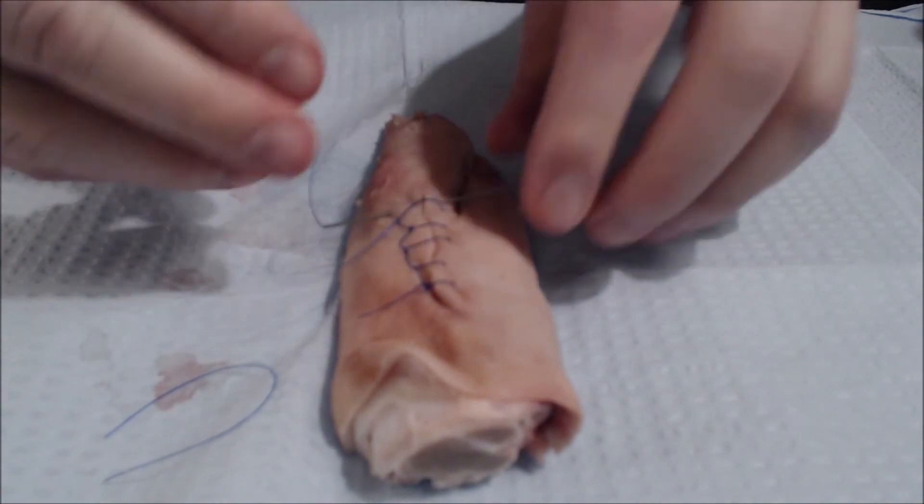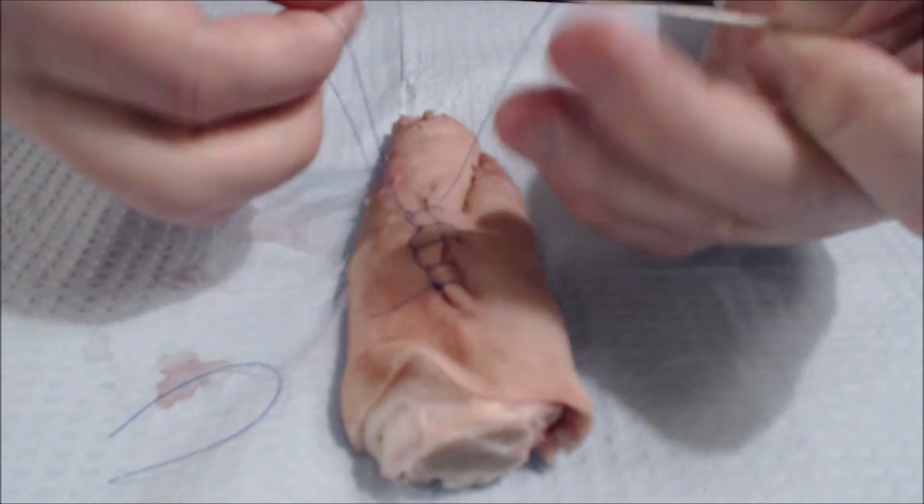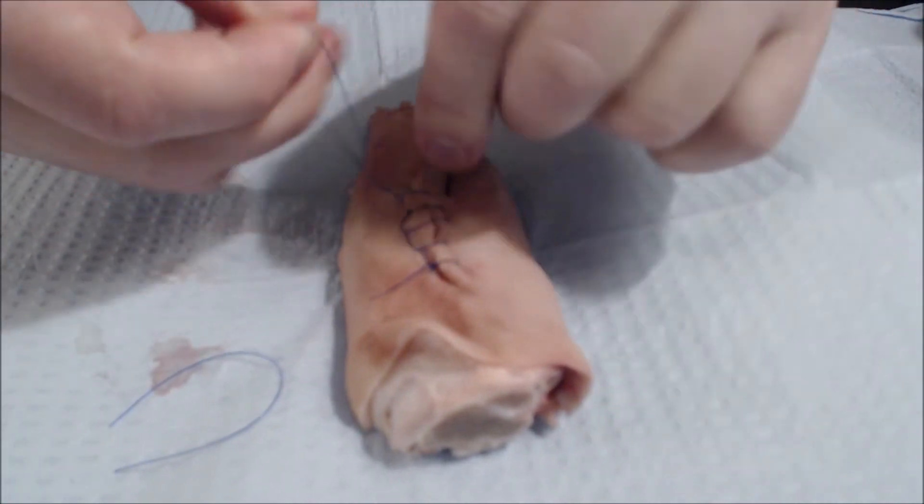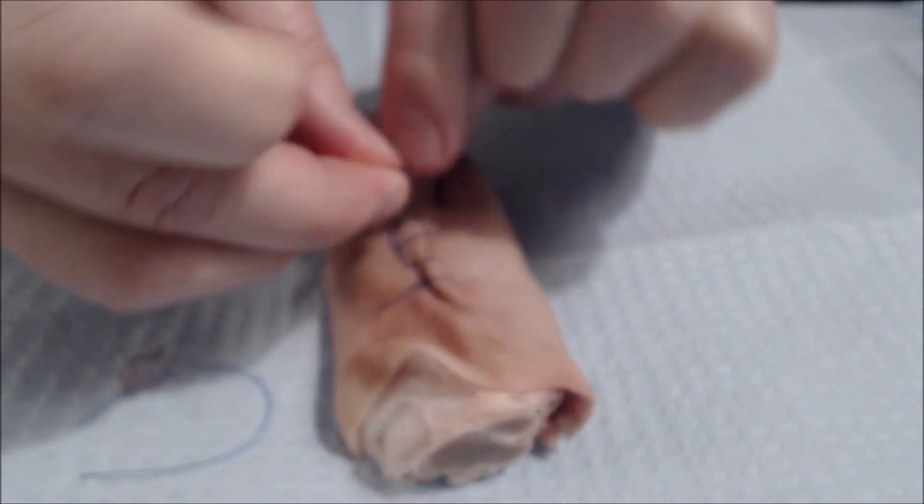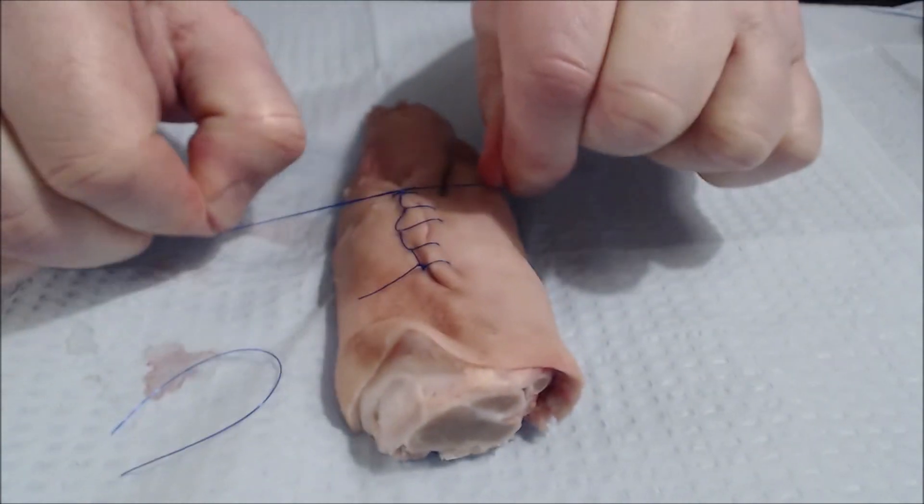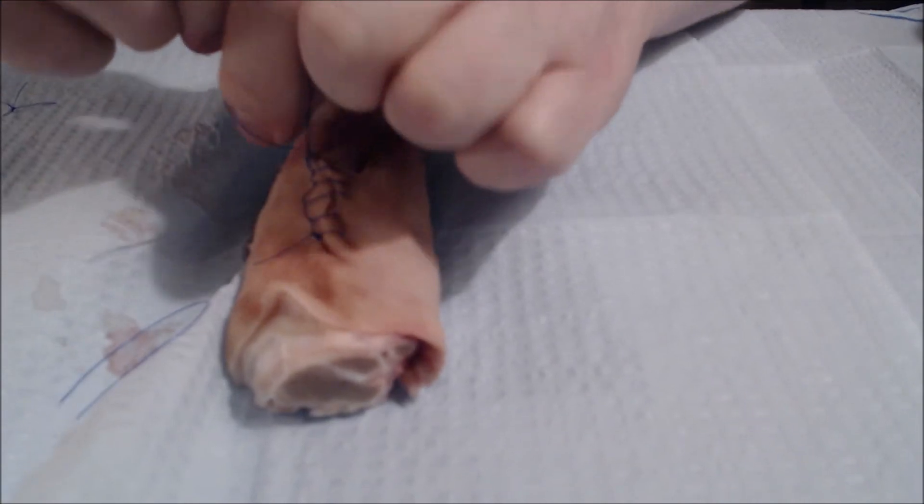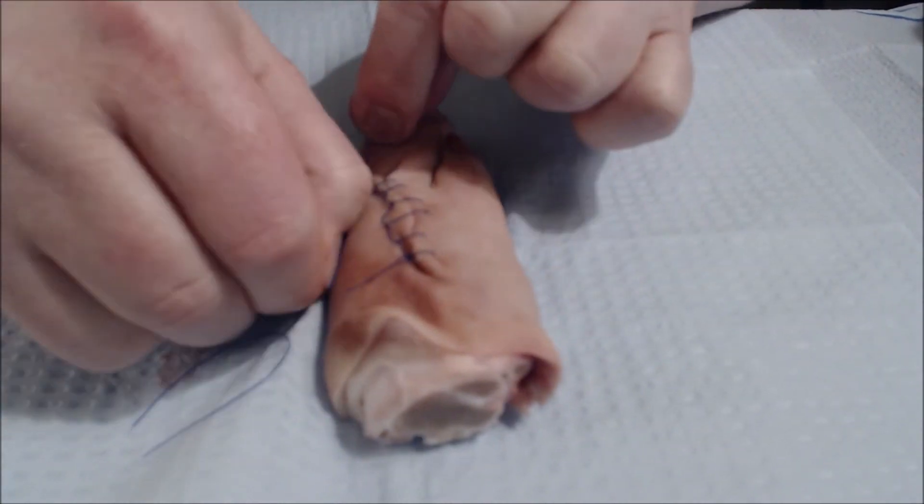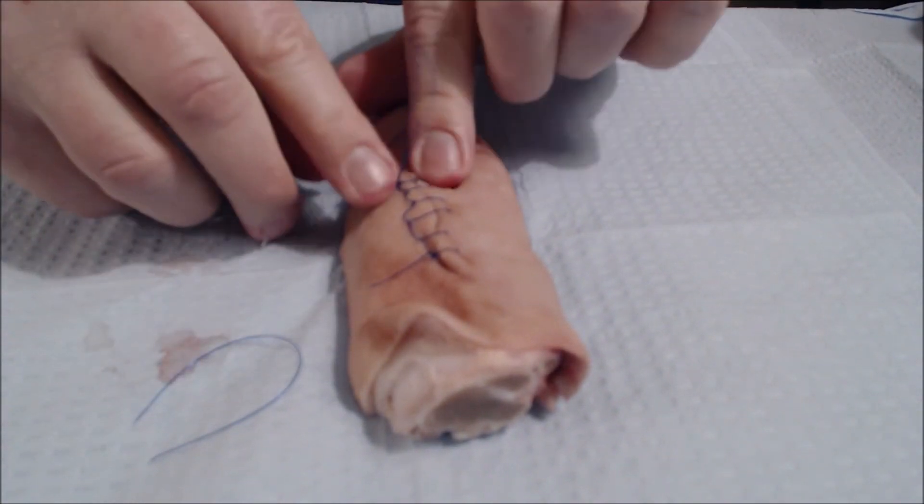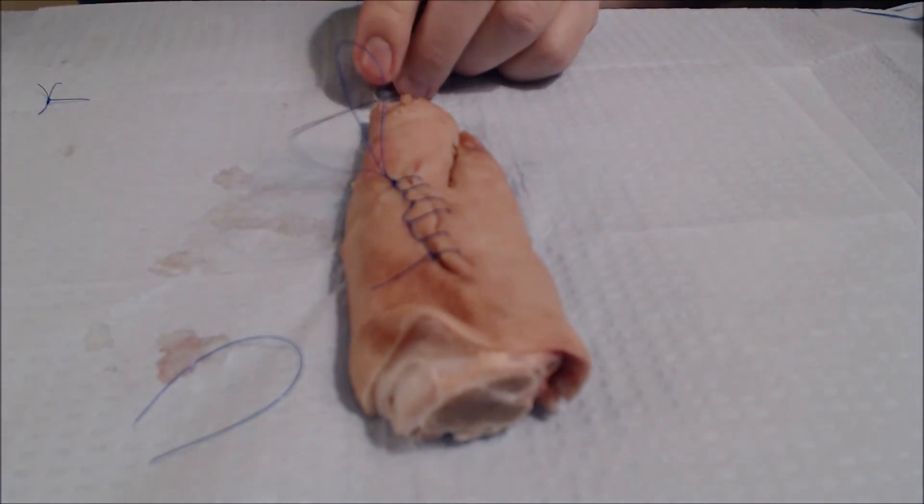We don't bring the needle through the loop necessarily, but we do tie it. Here our needle is getting a little short. Our suture material is just about all used up. And generally you would do at least four knots.